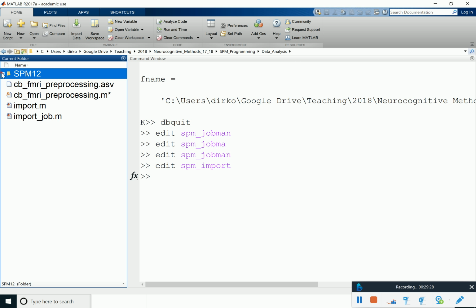Yeah, so the par and the rec files always go together. If there's a parameter file for Philips, there's also a rec file. The parameter file has the parameters and the rec file has the actual data. So that's sometimes what you find. The Nifty, I think, has everything in one. But if it's par, then par rec, if you specify the parameter file, then it knows that it has to look into the rec file as well. And there was another question.